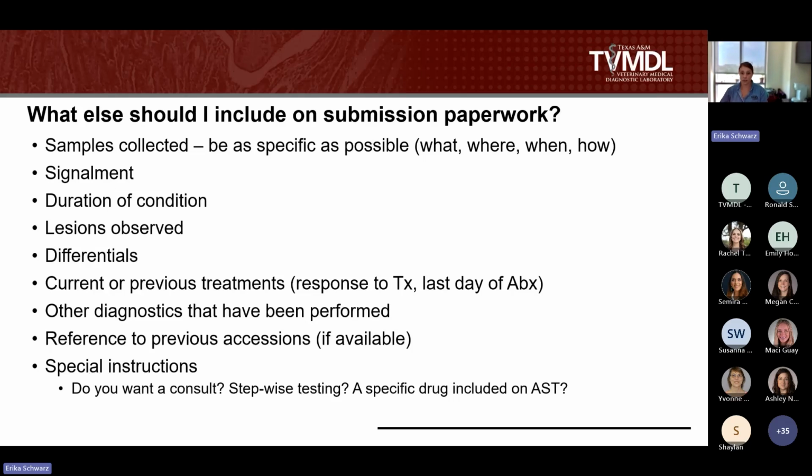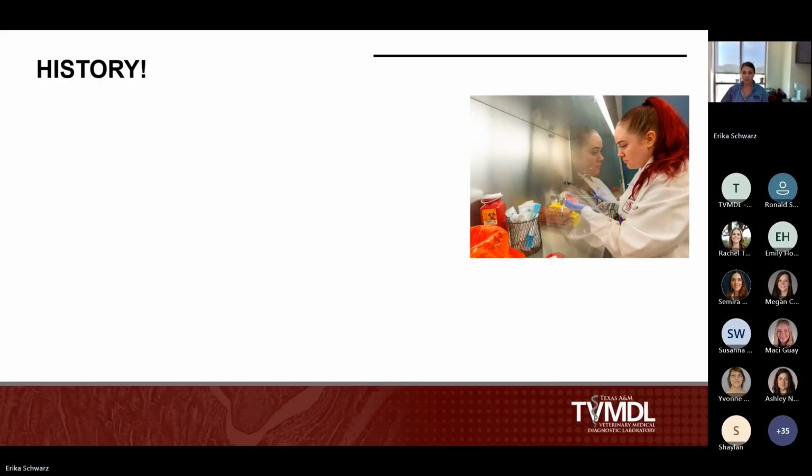Or do you just want it regardless? Specific drugs. If you are looking for sensitivities on a specific drug that you would prefer to treat with, we can certainly include that if it's feasible. Again, this is something I'll cover a little bit further down in the presentation, but that's an option sometimes. And then if you're not sure what test to request, that is not a problem. Just go ahead and give us a call. We'll help you through the process and figure out what's going to be the best option for your particular case.